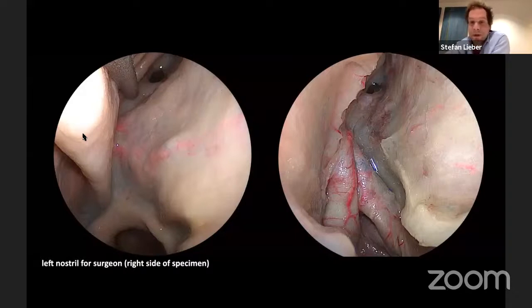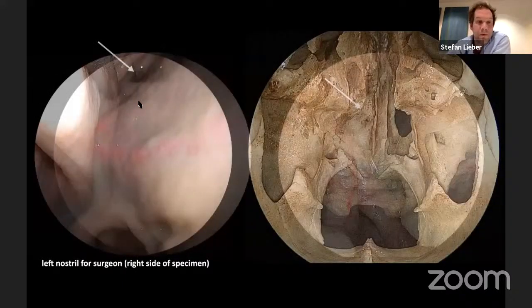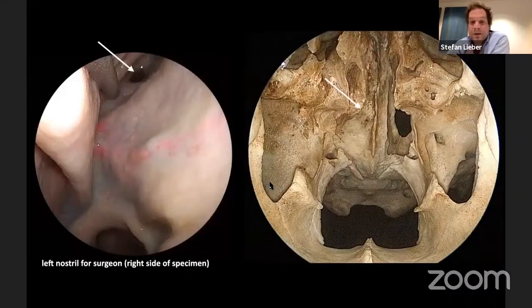the pterygopalatine fossa. I wanted to show this picture also because it shows nicely the connection between the thin bony septum and the diamond-shaped rostrum. And this is, depending on the strategy you use, one of the landmarks for the mucosal incision and disconnection if you do a posterior mobilization of the septum or a septectomy or a binostril access in the posterior septectomy window.